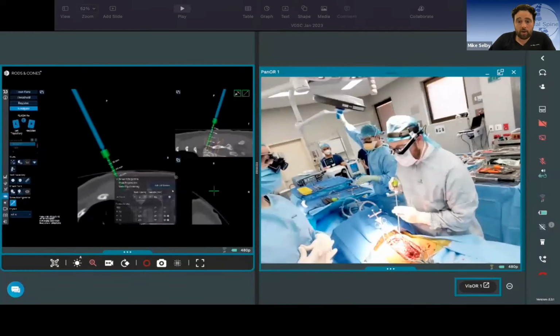And when you're operating at the very cranial and caudal end, there are some little tricks you have to use because you want to preserve the midline ligaments a lot there. You can't use the tip of the spinous process. And it is nice to use bone surfaces at multiple levels. So you don't just want to use the laminar, you want to use tip of spinous process or tip of mammillary process. And that gives you your registration there.